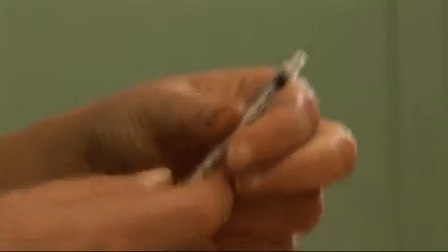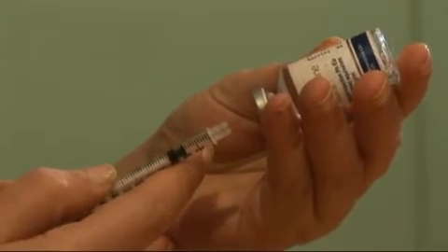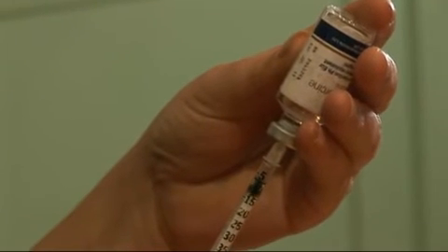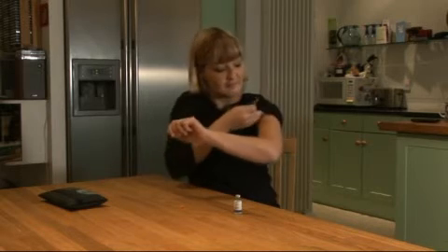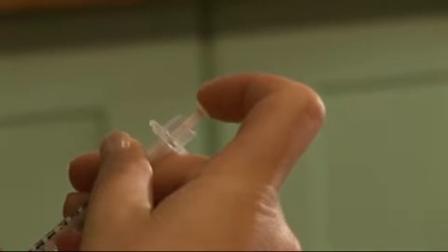Because I've had diabetes such a long time, I can't get out of the habit of using a syringe. What you do is you draw up air, pump it into the vial, which is a small bottle, and then you draw the amount of insulin out that you need. Then you have to inject, whichever method you use, into a fatty area, i.e. your thighs, your stomach, your arms, your bum. And some people even do it in the calves, but that's very, very rare.